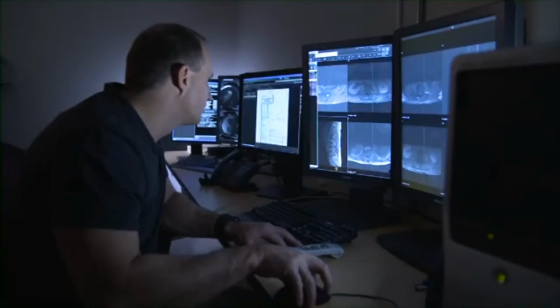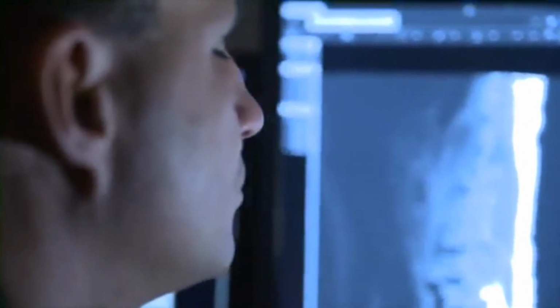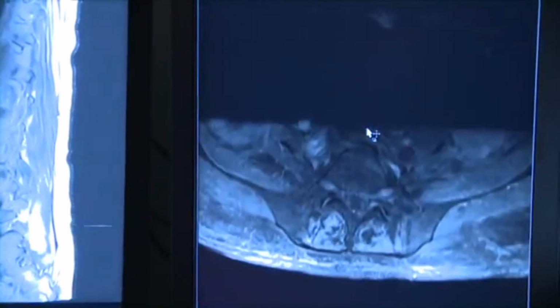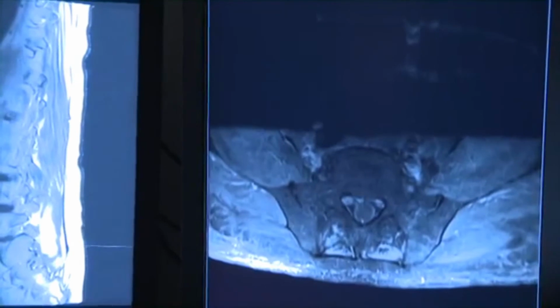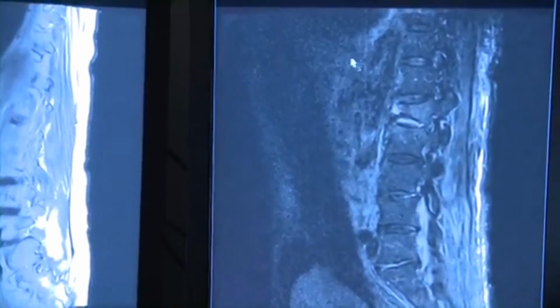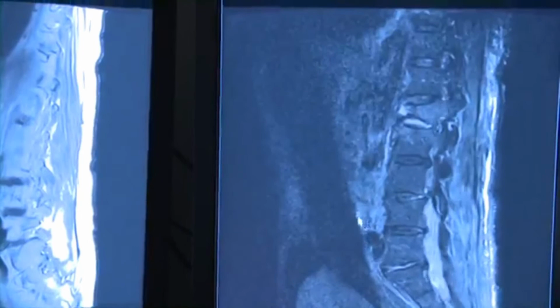Our turnaround time is much improved too with PACS because the images are available. In the past, if the film were in emergency, we wouldn't be able to interpret them formally because the emergency doctor was doing it. We might see something that the emergency doctor missed, and now because the images are available to us at the same time, we're quicker in terms of getting the reports to emergency and so on.